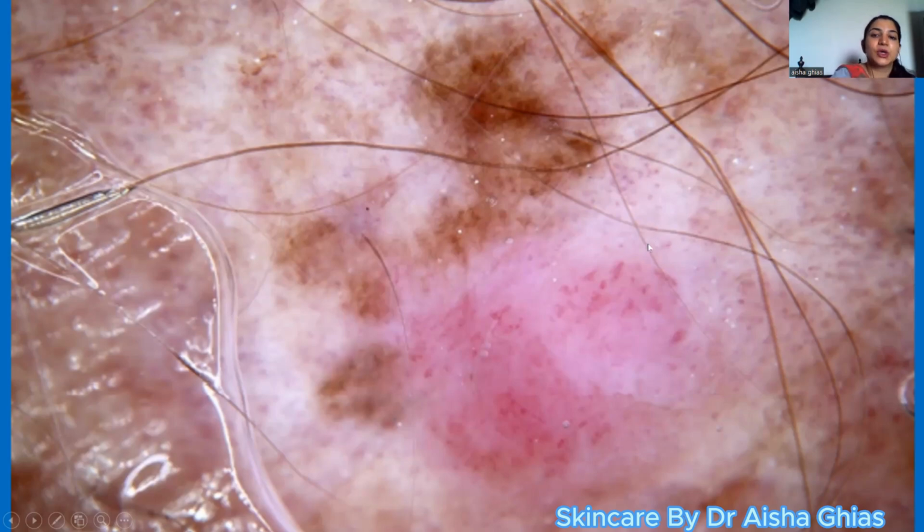They might be present around the whole periphery of the lesion, or they may be in the center of the nevi. But over here, there is an eccentric structureless area with a little bit of peppering inside. So what is peppering? Peppering is dot-like gray structures. If you're following this white cursor, the dot-like structures in the whitish background are called peppering.